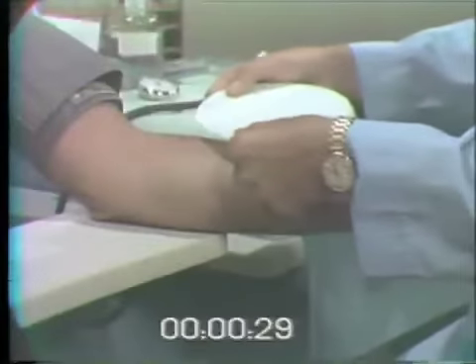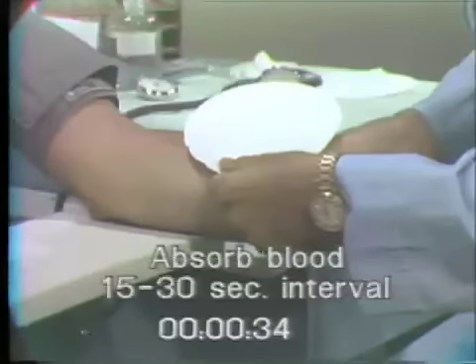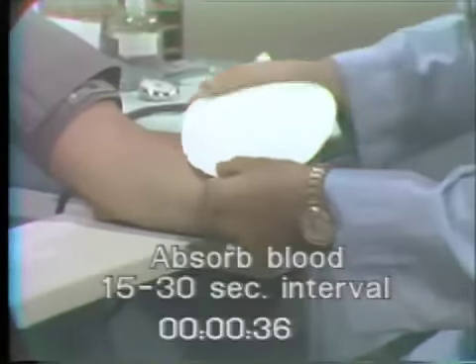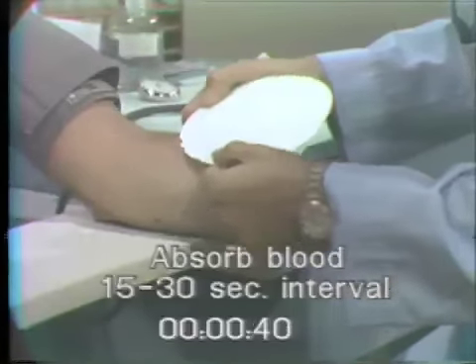You take the filter paper, come up adjacent to the wound, but do not touch the wound, and draw the blood up. Again, we'll wait about 15 seconds, and again come up to the wound, drawing up the blood.